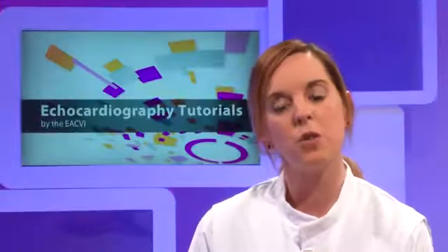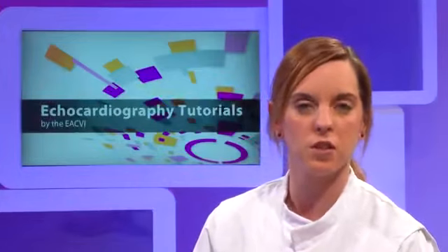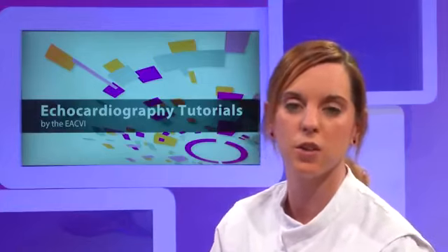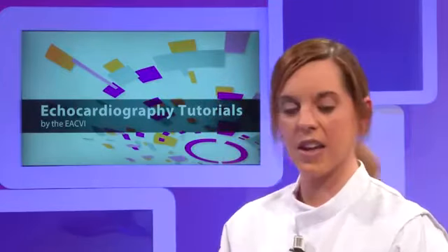I will show you how to evaluate a mechanical prosthesis in mitral position. Before starting the exam, it's really important to ask the patient for the height and the weight to calculate the body surface area, and also to take the blood pressure. So now we can start the exam.